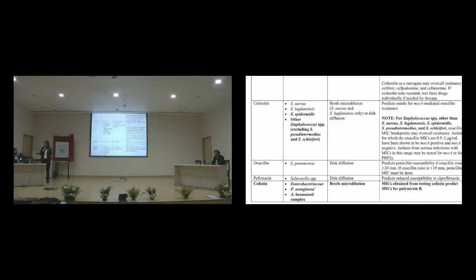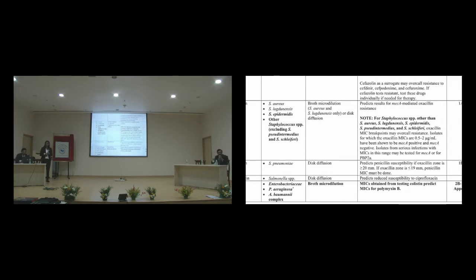No, ceftriaxone and cefotaxime, if it is an equivalent agent, it means what? It's very simple. Equivalent agents belong to the same group. Surrogate agents are usually of a different group. We don't write the surrogate agent on the report. We don't report the surrogate. Yes, exactly. My one more question, sir.